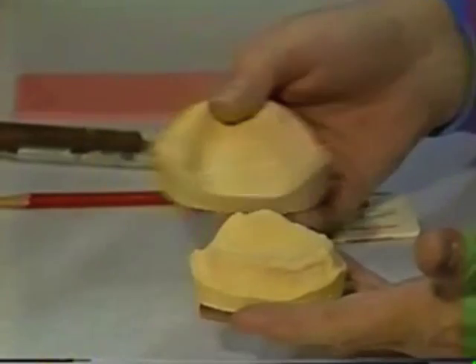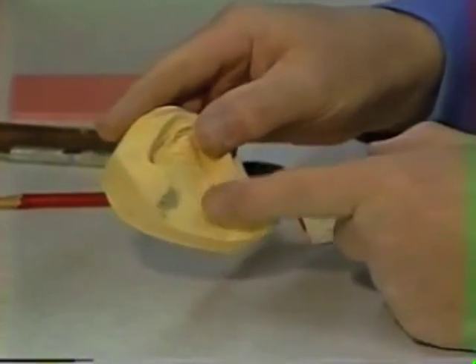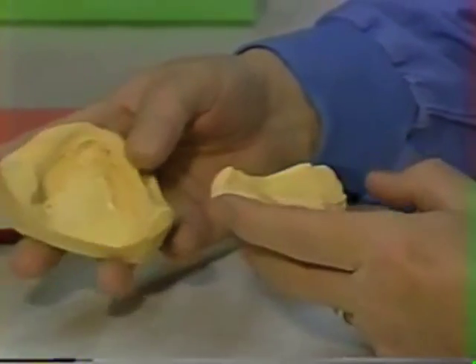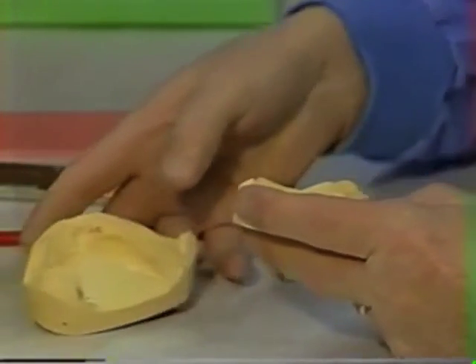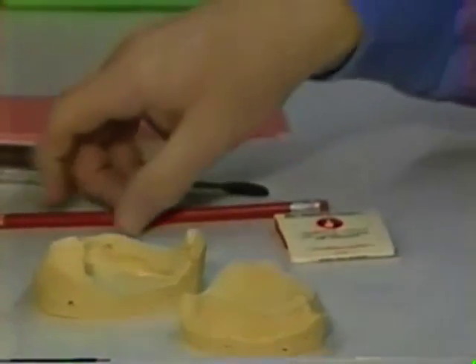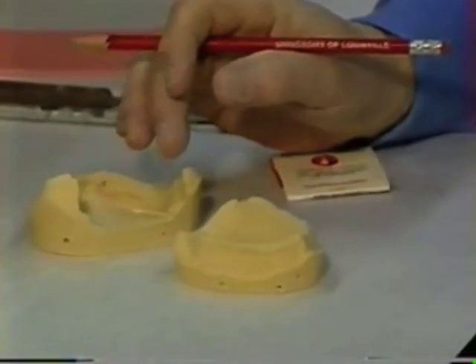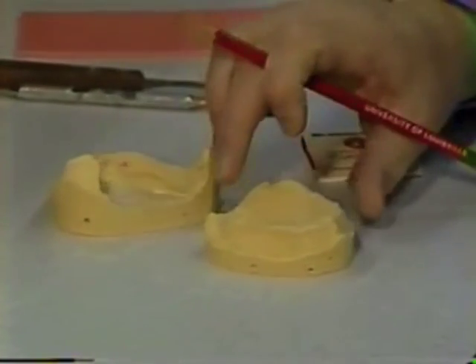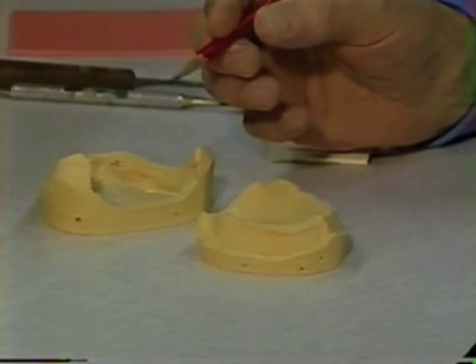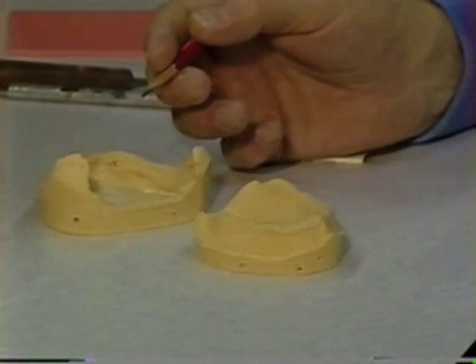Last time we poured the cast so that we wouldn't have this tongue space all obliterated with stone. We poured it in such a way that we can get to all of the peripheries and be able to make a tray. Now, the first thing we want to do in determining our trays is look at the anatomy of the mouth, look at the cast, and try to determine what the length of the periphery should be.